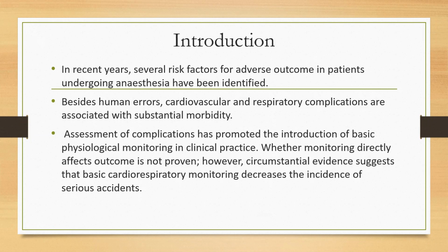Assessment of complications has promoted the introduction of basic physiological monitoring in clinical practice. Whether monitoring directly affects outcome is not proven. However, circumstantial evidence suggests that basic cardiorespiratory monitoring decreases the incidence of serious accidents.